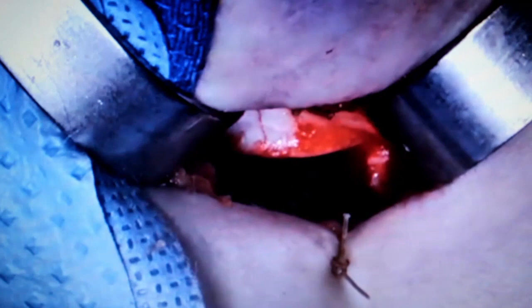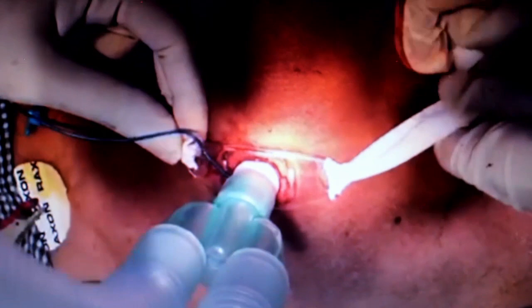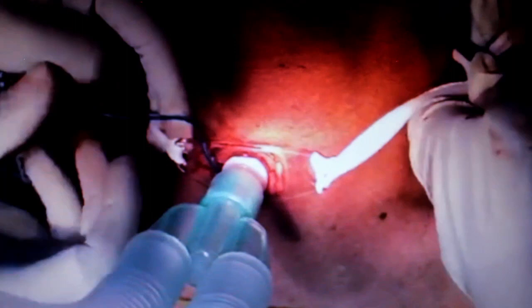And if you are doing it under general anesthesia, carefully withdraw the endotracheal tube before inserting the tracheostomy tube. And after putting the tracheostomy tube, either suture it to the skin or tie it securely. Okay.